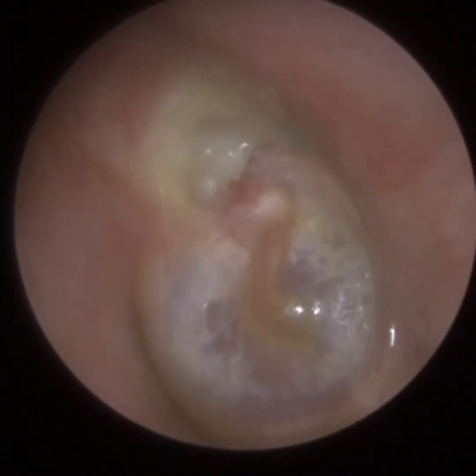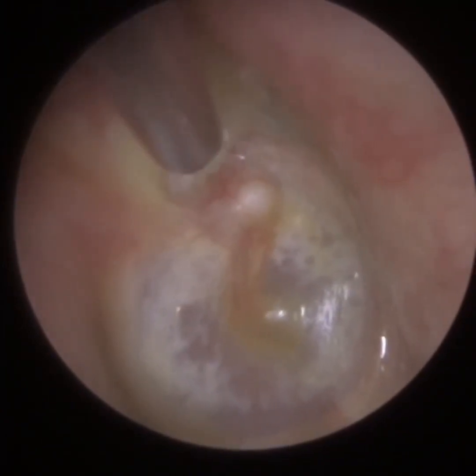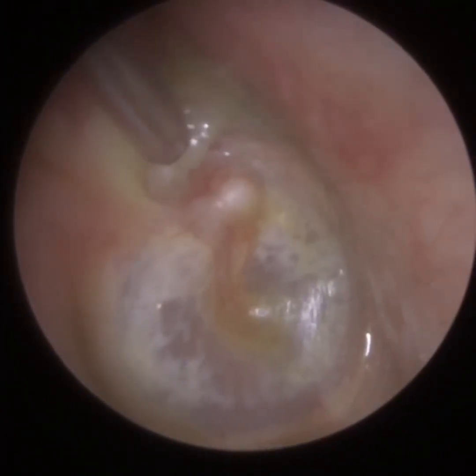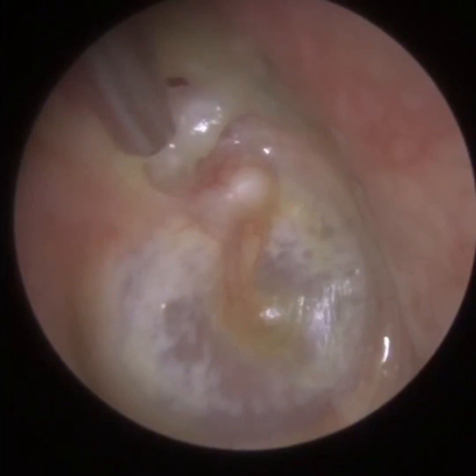If you look at the top of the eardrum, more specifically the posterior-superior quadrant — posterior means the back part of the eardrum, and superior means the top — we have this wet, what appears to me to be dead skin.